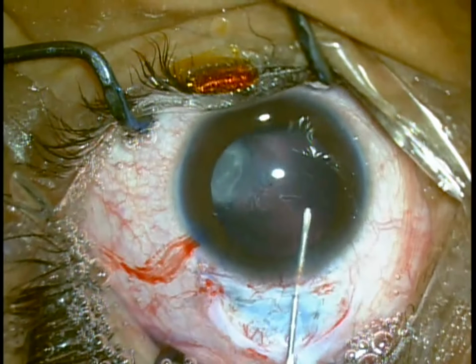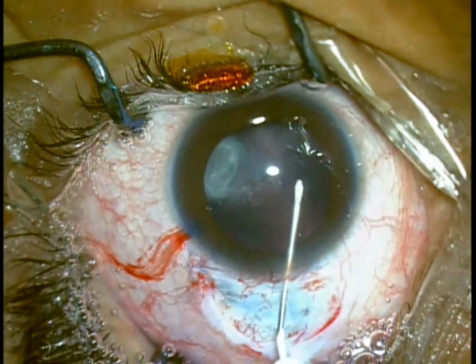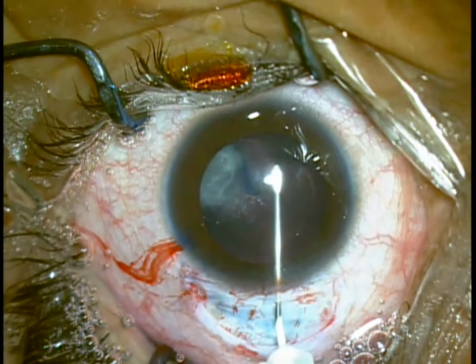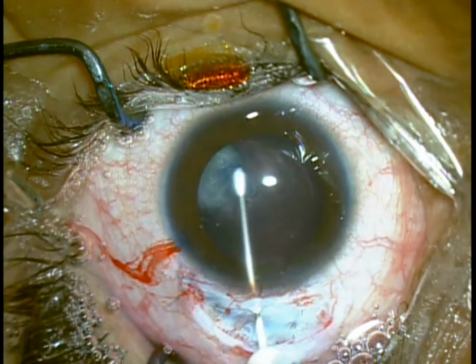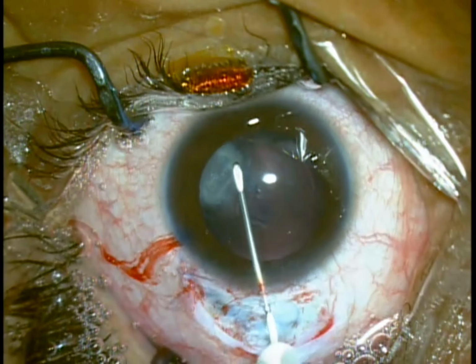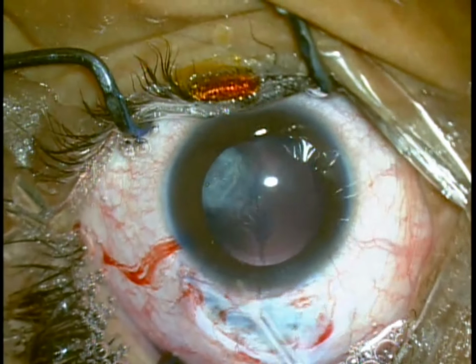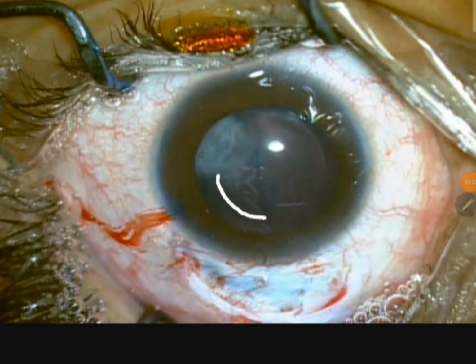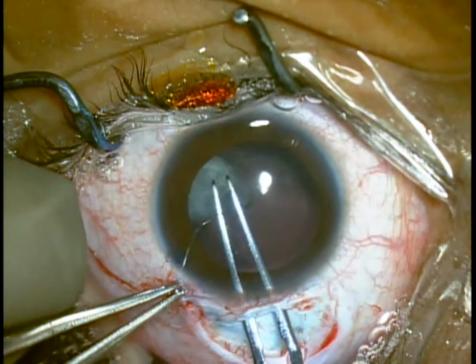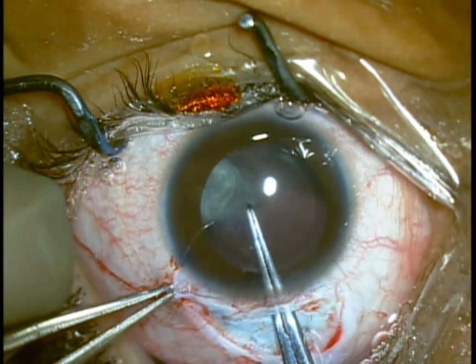Rhexis was begun away from the temporal cataractous part of the lens. Almost half of the rhexis was completed with cystotome. As the rhexis was attempted over the cataractous part, the surgeon here is finding it difficult to complete the extending rhexis from the uneven lens surface due to the cystic invasion. Here, the surgeon uses Utrata forceps trying to complete the capsulotomy in the inferotemporal part.